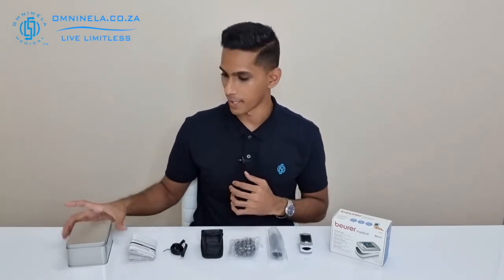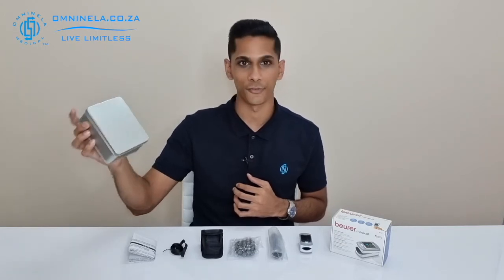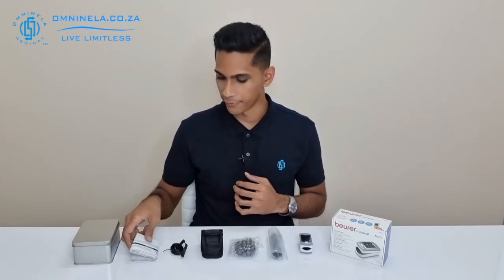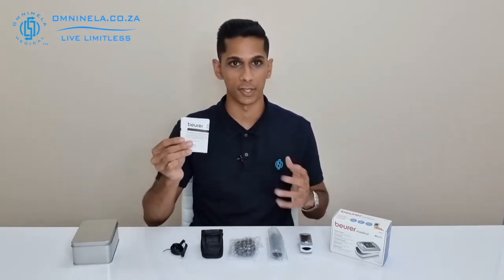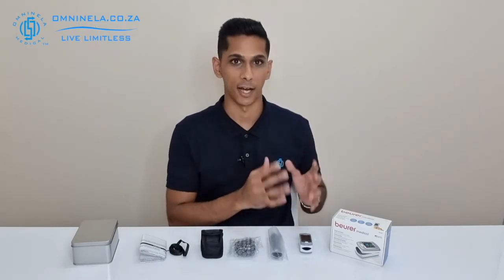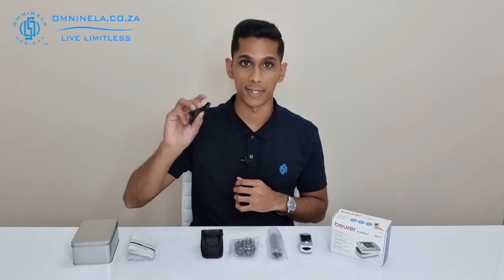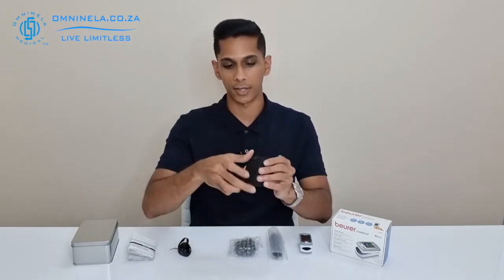Now that we've got everything opened up, we can have a quick look. We have a hard metal case where you'll be able to keep all of your accessories in one place. We've got the instruction manual, which is very good to read through on first startup — it will teach you how to set up the device for the first time and get the most functionality out of it. We've also got the retaining strap and the belt loop pouch for when you're on the go.